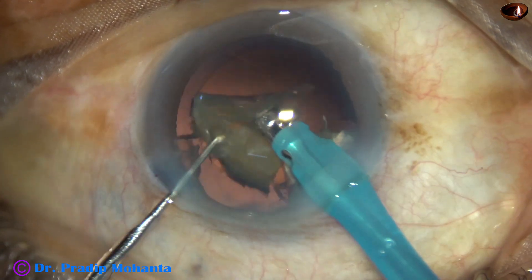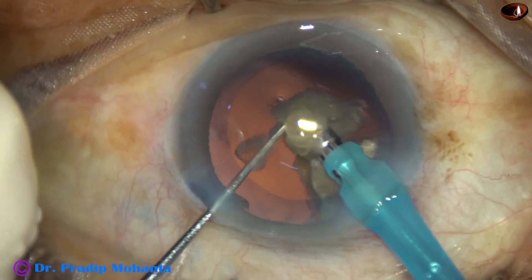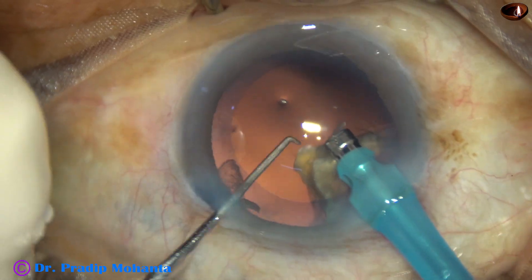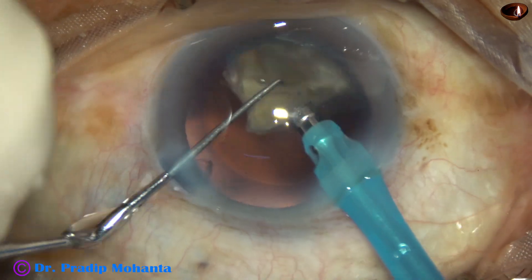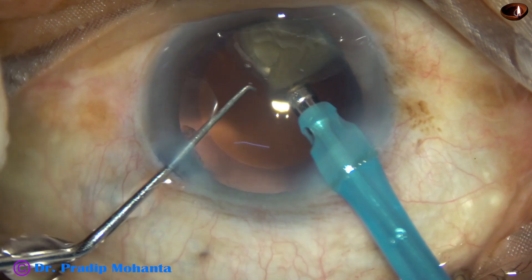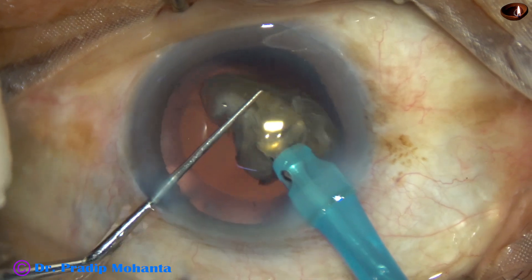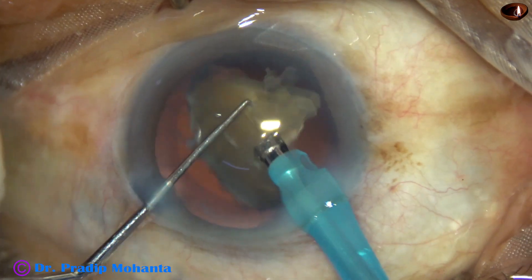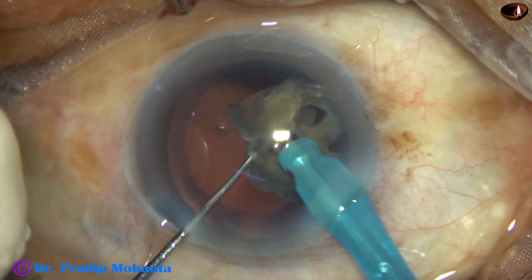This is the last piece of the cataract. At this time, during emulsification of the last portion, I reduce the parameters: vacuum is 250, flow rate is 25, and ultrasonic energy is 75%. Now very carefully the last piece is emulsified.